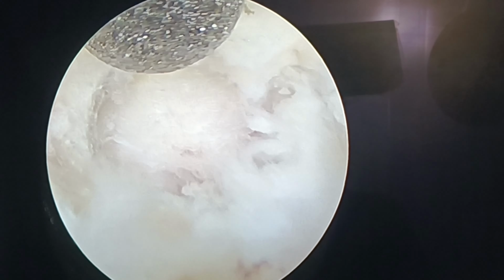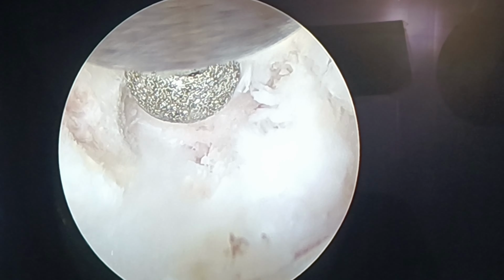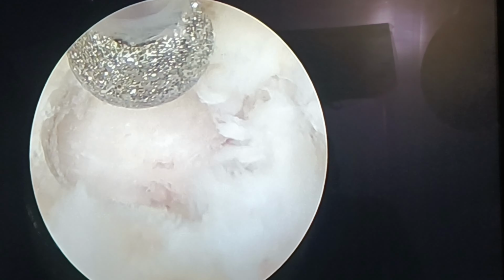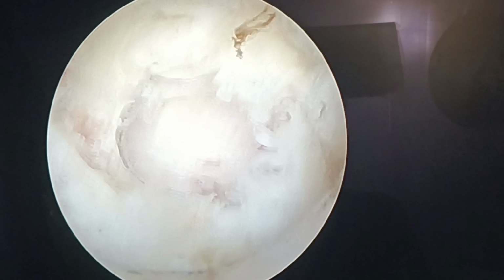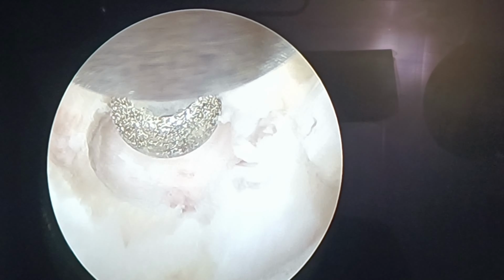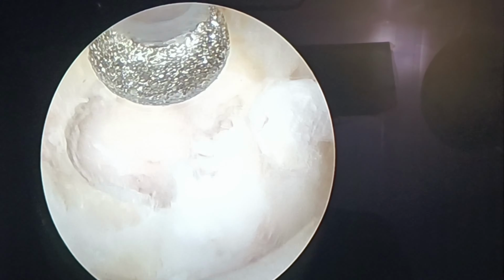Now we have almost completed IAP drilling, and now we are proceeding towards the SAP drilling on the ipsilateral side, that is on the left side. The white structure that you are seeing is the SAP.